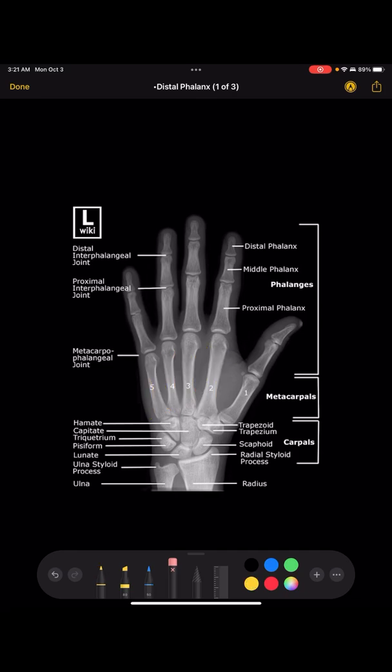You want to make sure there's no soft tissue overlap. If the fingers are too close together, the soft tissue would overlap, so you want all the fingers totally separated. You should be able to see the soft tissue shadow of the hand and skin, and you also need to be able to see the bony trabecular patterns — the subtle striping that shows the bones aren't perfectly smooth.